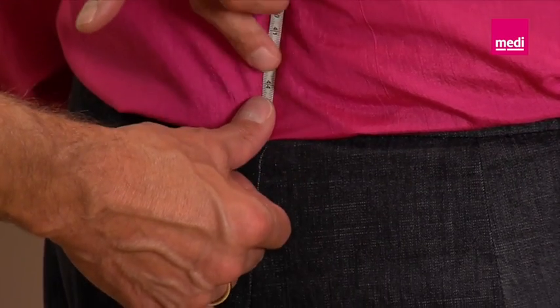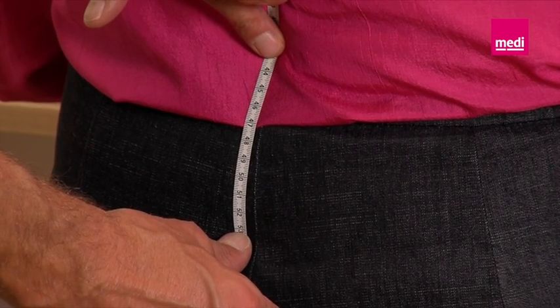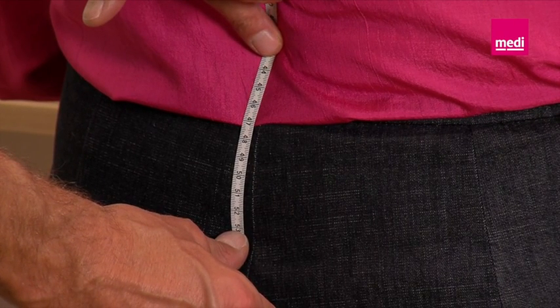Make sure that the tape measure follows the spinal curvature over the entire path of the spine. Now that the distance from C7 to the sacrum has been determined, you can decide on the right size of back splint from the product table.